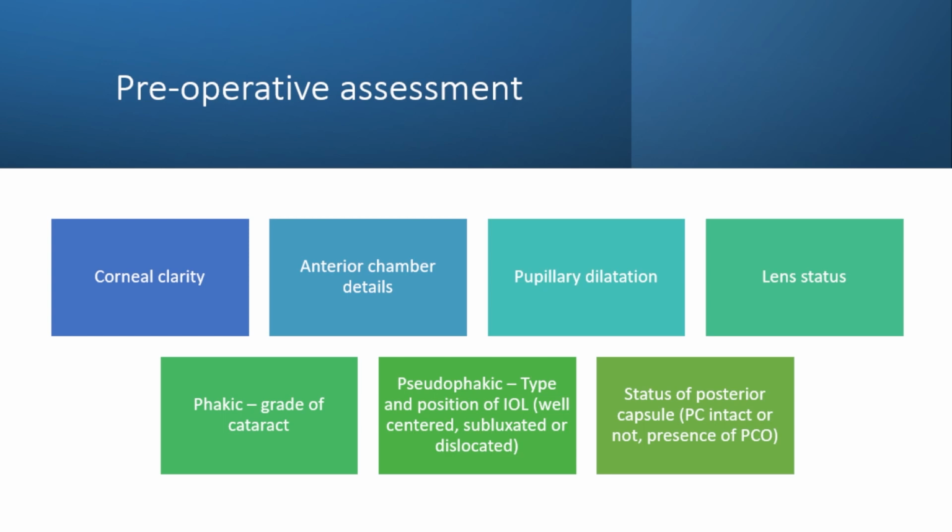There are many who remove glasses and incorporate the power in the microscope adjustment so that they don't need to wear glasses, which is fine. But if you have a little bit of cylinder or you're a presbyope like me, where you need to have near vision outside the microscope also active, you continue to retain the glasses on when you're operating, okay?